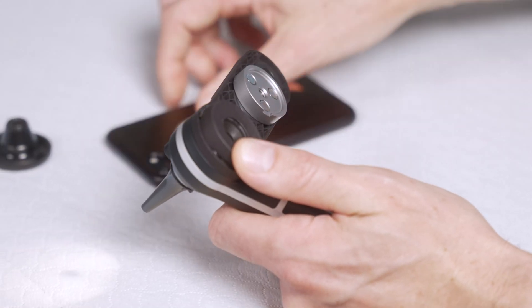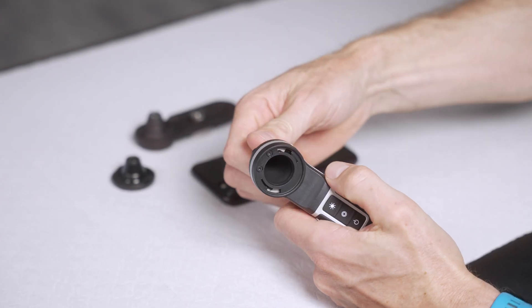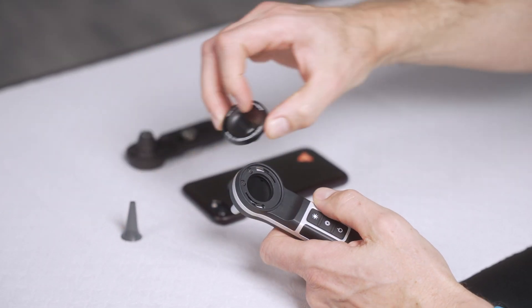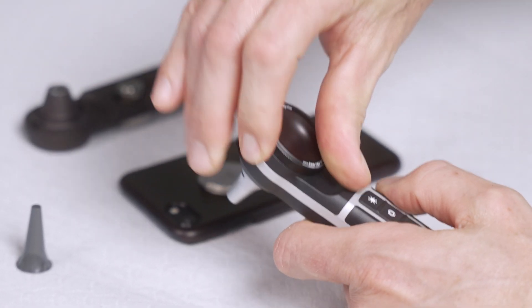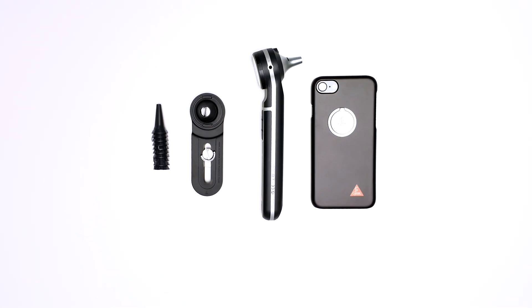When finished, take off the smartphone and the adapter and reinsert the magnifier module into the otoscope. The Beta X-Otoscope is now ready for regular use again. Find all information on Heine.com.